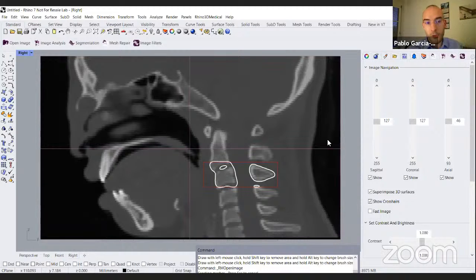And Grasshopper, I don't know exactly the capabilities, but they are pretty high. In the end, it's a Python interface, so it depends also on how up to the task Python is. It should be. We have GH Python and it should be compatible.